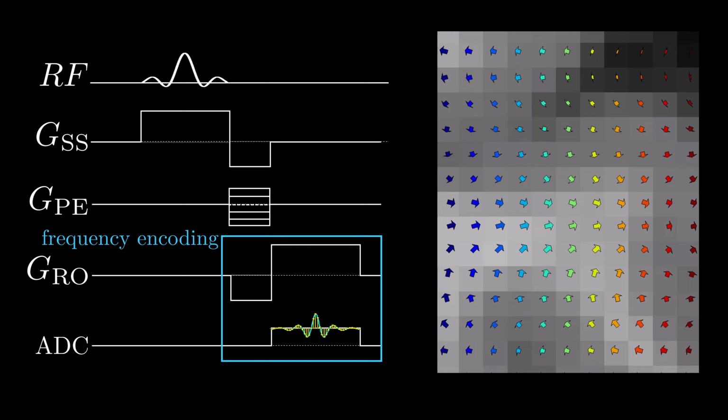I find that very often textbooks will stop here, leaving you with the pulse sequence procedure, but little understanding of why the protocol is set up this way and how each step works. My goal here is to elucidate the connection between the physics, technology, and math as best I can, but don't get discouraged if it doesn't make sense all at once. MRI is a complicated technology, and every individual piece of this system was somebody's PhD dissertation. I'll do my best though.